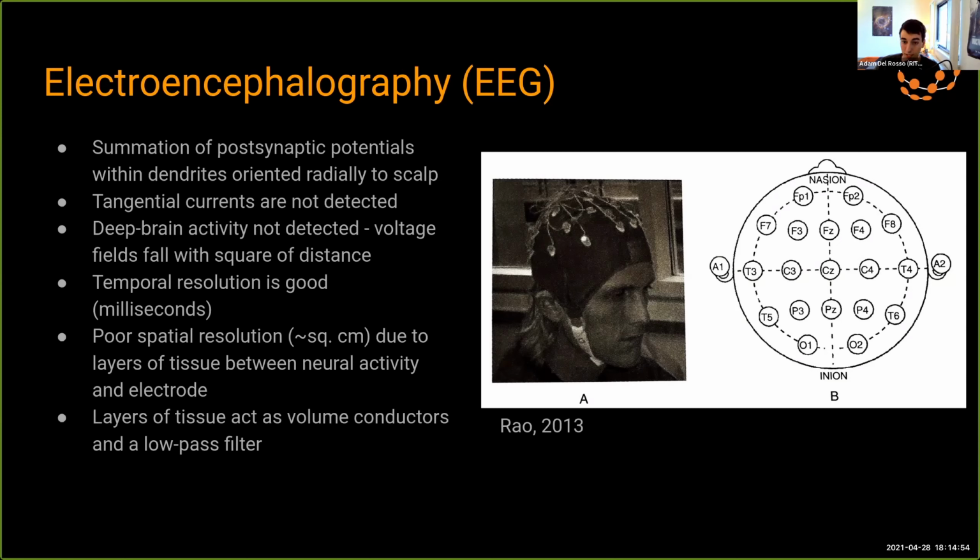It isn't the most comfortable thing in the world, but it gets the job done. And the electrodes, if you can see here, these are spike electrodes that will actually try to go through your hair to make a good contact with your skin. And there's flat electrodes as well to go against forehead or any exposed skin. And these are just spring-loaded electrodes. They're actually just plastic, but they have a highly conductive coating.